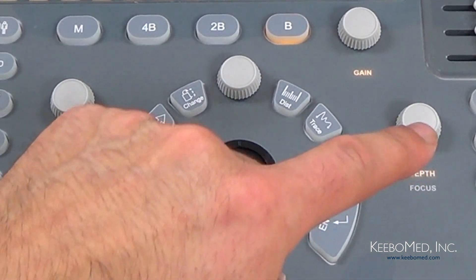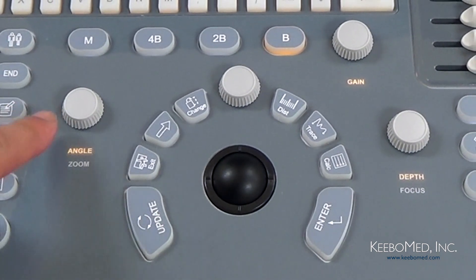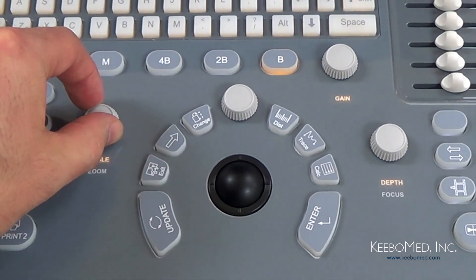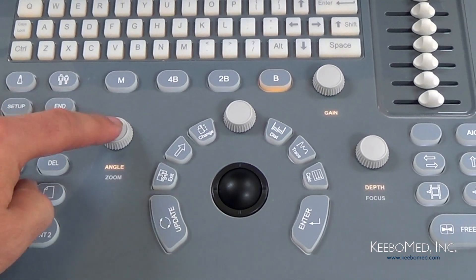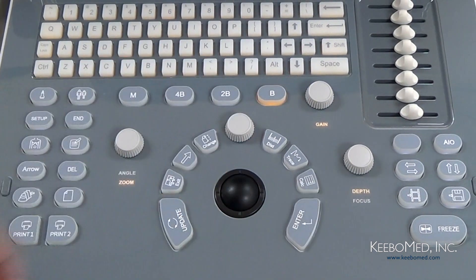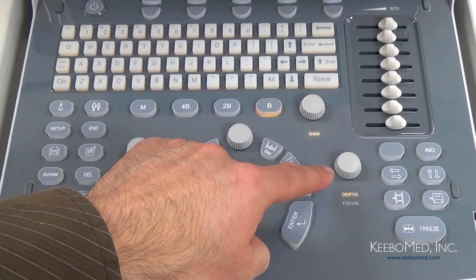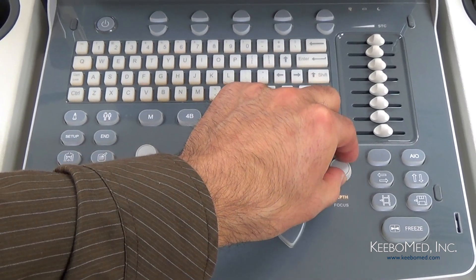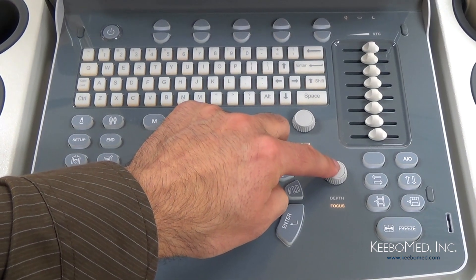There are three other knobs close to the center group of keys. First we have the Angle and Zoom knob — simply rotate to adjust the angle or zoom, and press the knob to change the function between angle and zoom. Then we have the Gain knob, which is used to adjust the gain of the B mode and M mode. And then we have the Depth and Focus knob — rotate to adjust the depth or focus position, and press to change between depth and focus.